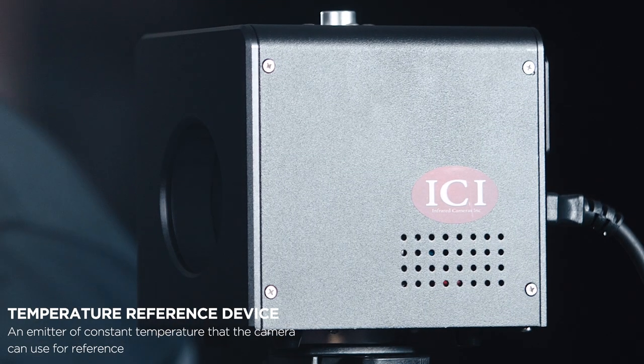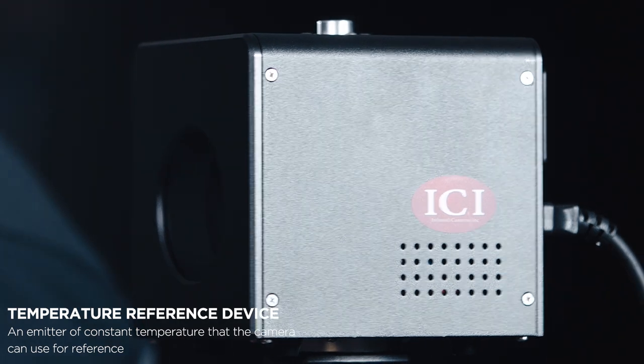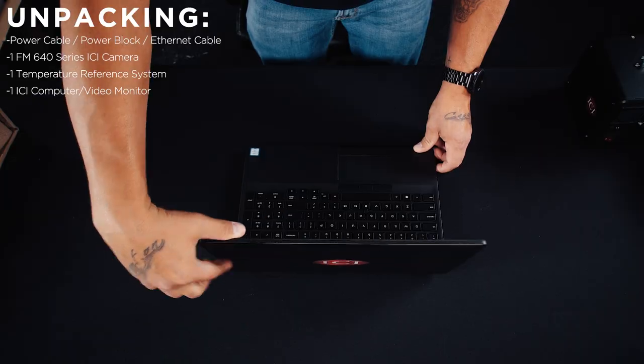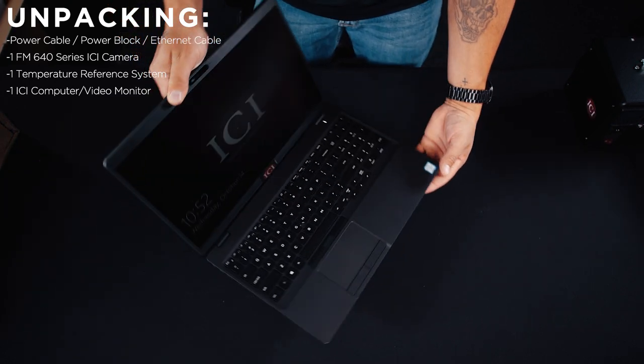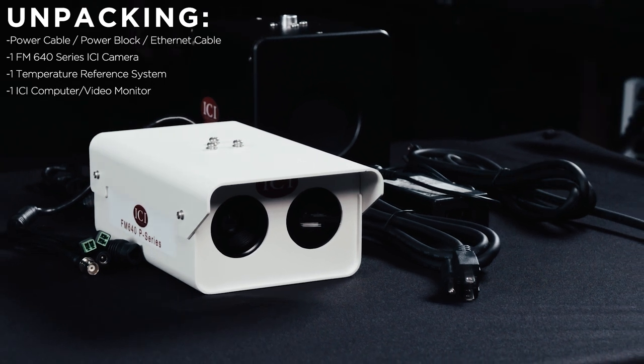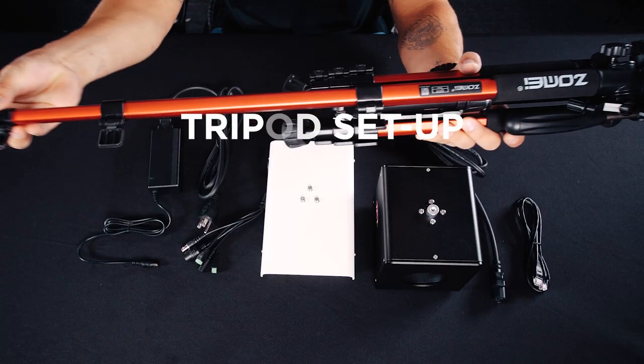This is a temperature reference device. The temperature reference device is an emitter of constant temperature that the camera uses for reference. At last we will find a computer and video monitor combination. These are all the components that are included with your system.